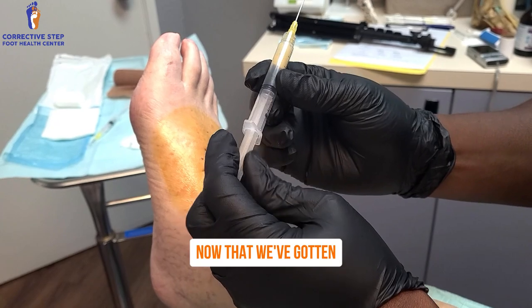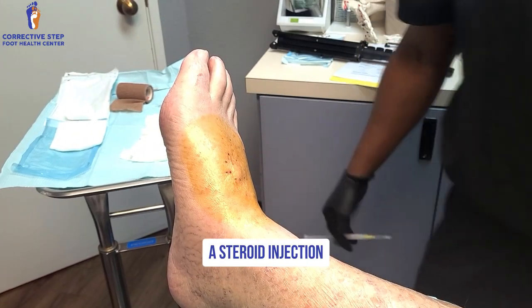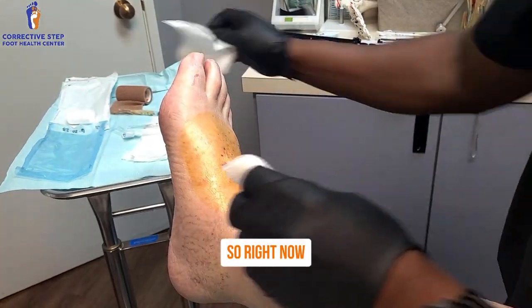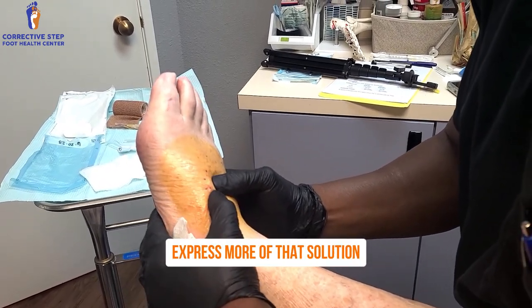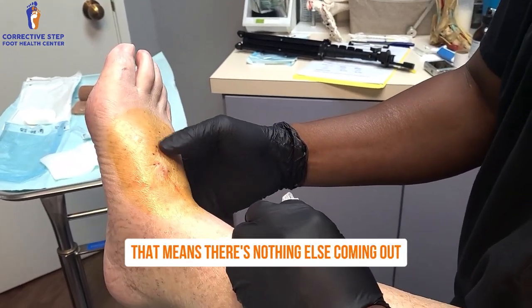Now that we've gotten the majority of the fluid out, we always prepare a steroid injection to help prevent the cavity from filling right back up immediately. Right now you can see me trying to manually express more of that solution or fluid that's within the foot. We see it's nice and bloody — that means there's nothing else coming out.